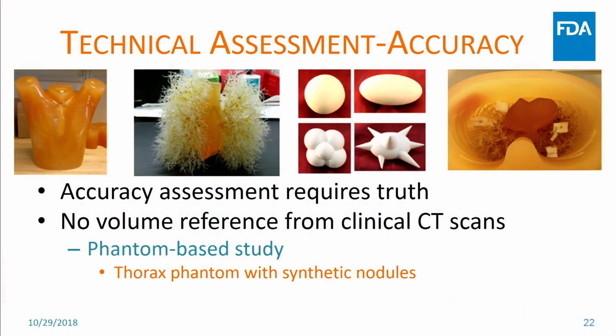So I'm going to talk about just 2 different parts of this, accuracy and precision. Same basic statistical concepts that have been talked about before. For this particular case, when we're talking about accuracy, one of the problems in imaging studies is we don't have a reference for in vivo clinical studies. What's the size of a lesion in a CT image? I don't know. I can get 5 radiologists. They'll take a look at that. And depending on how complicated that region is, we could have variability of 10%, we could have variability of 50% in that measurement. So what's the real truth? Well, we don't know that.